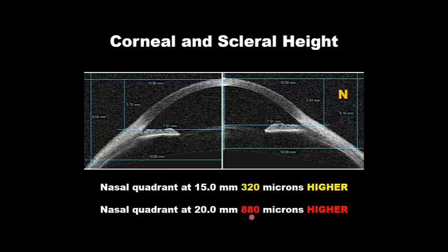Now, so what? What does this tell us? Well, the scleral lens is going to hit the nasal aspect first and hardest. It's going to want an opposing point of bearing, so it's going to tilt its way and drop down farther on the temporal side and be closer on the nasal side. So what am I saying exactly? When you place an ICD or any scleral lens on the eye, what you'll generally find is that there's a thinning on this nasal aspect.